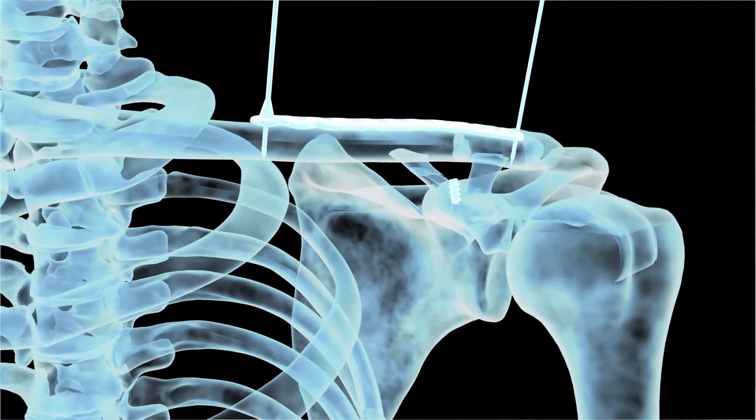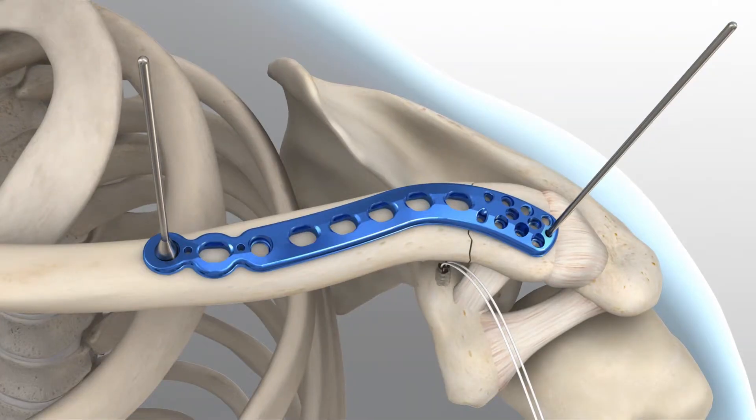For early stability, the first two screws placed should be medial and lateral to the fracture site. If bicortical screws are used, precautions should be taken to avoid overpenetration of the inferior cortex.